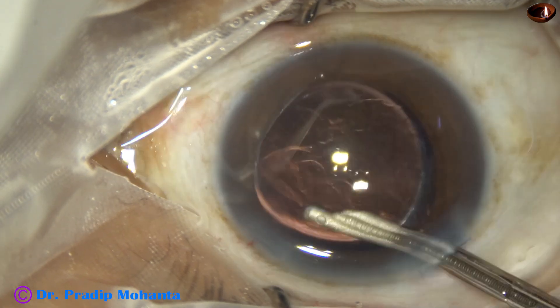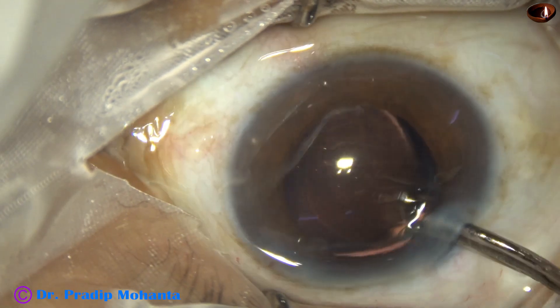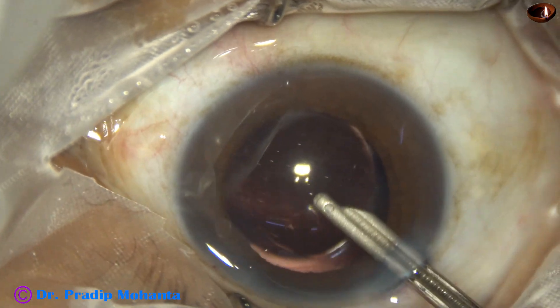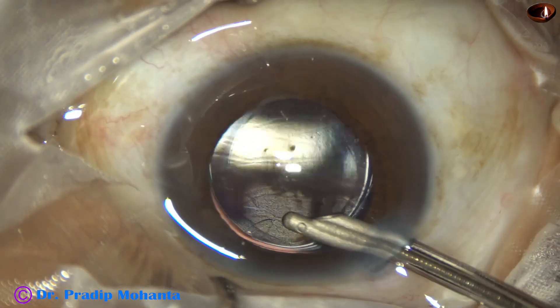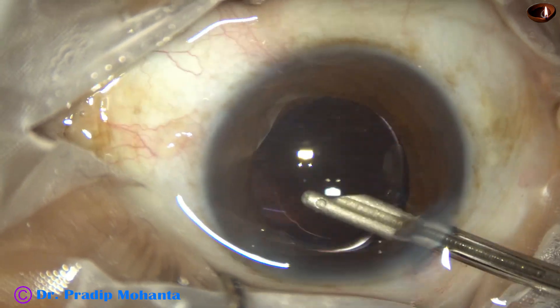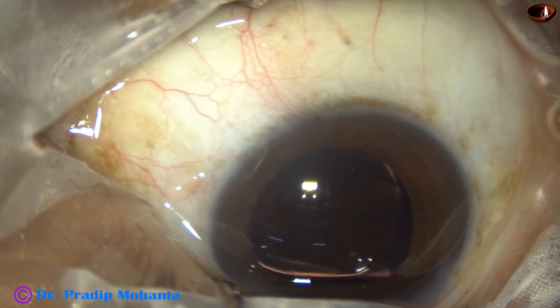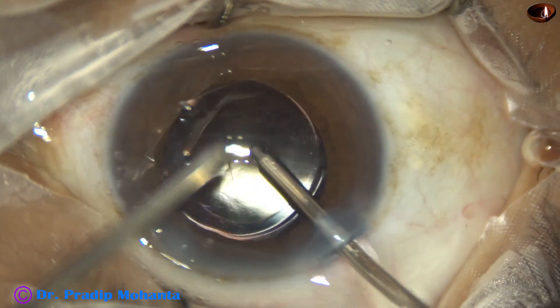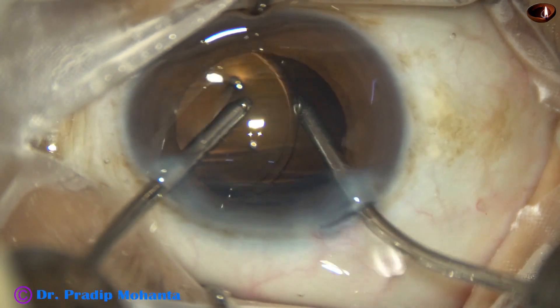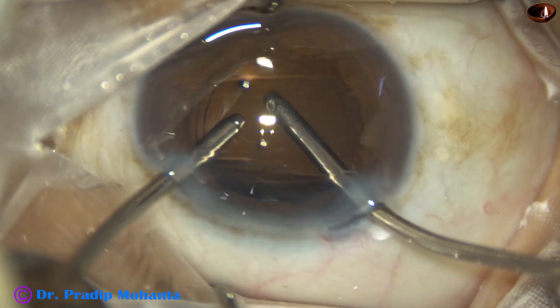Go behind the lens and irrigate the capsular bag. Come in front of the lens and irrigate the anterior chamber. Again go behind the lens and irrigate the bag. Irrigate and aspirate for some time. The irrigation probe has gone behind the lens; aspiration is from above. I take bimanual irrigation-aspiration cannula and irrigate and aspirate for some time. The irrigation probe has gone behind the lens; aspiration is from above.